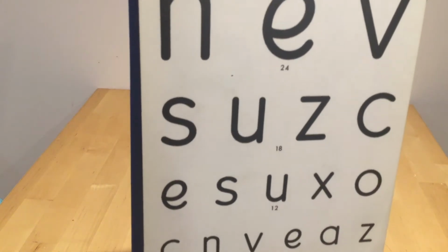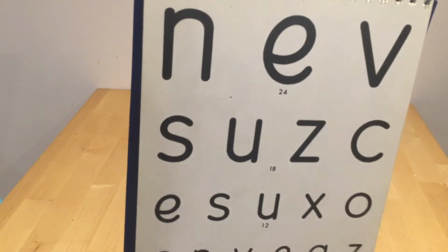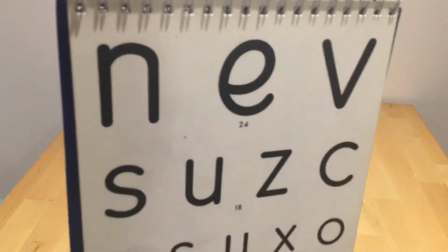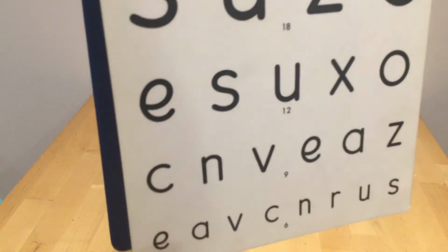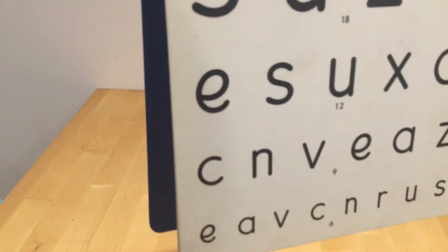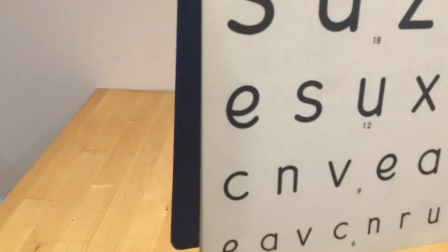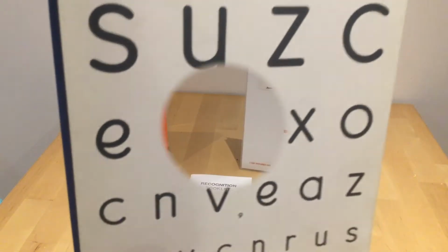Look very carefully at head position. Is there a head tilt or a head turn? And look as well for the child or young person speaking the letters less fluently. You will see that each line has a value, and record carefully where the young person or the child stops and they're unable to read the letters any further.